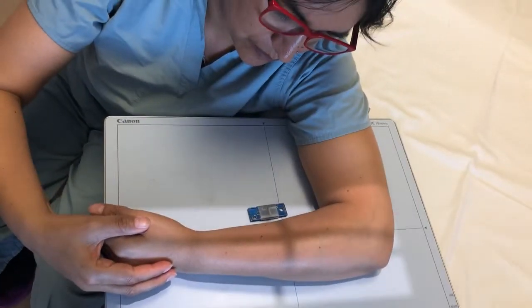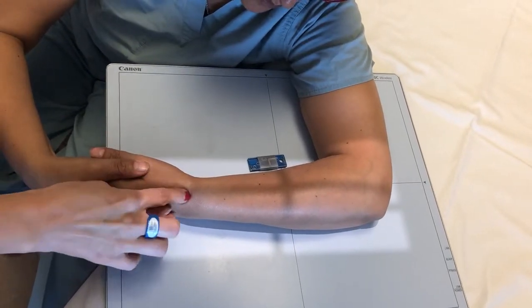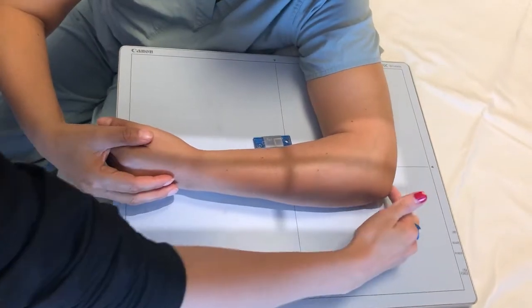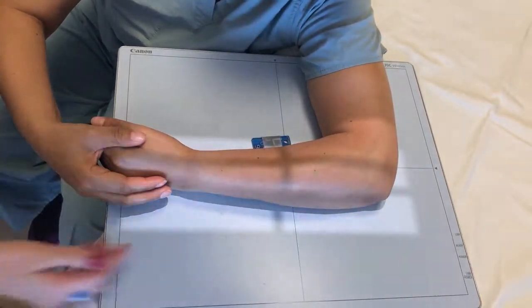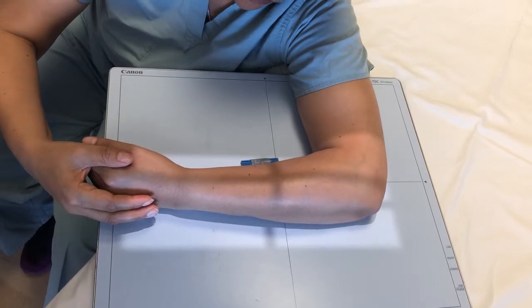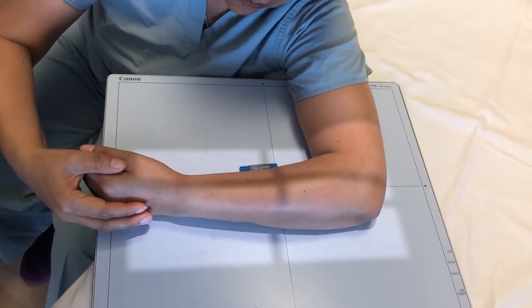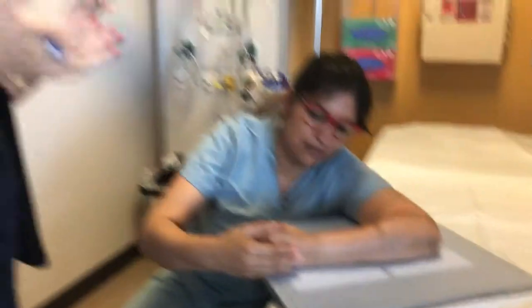And I'm going to adjust the collimation. You will get some of the carpals and some of the metacarpals. And you want to make sure you have all the way back to the olecranon, all the way back. You want to make sure you have light covering all the way. Open that up just a little bit more. So this is how you would position a lateral forearm view.